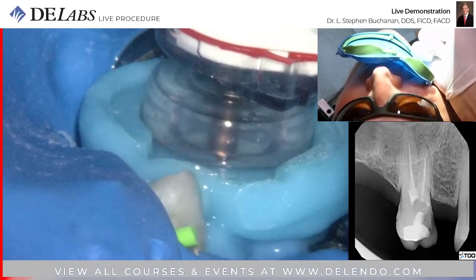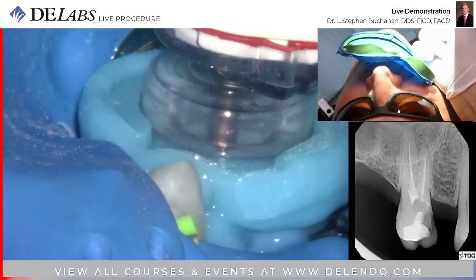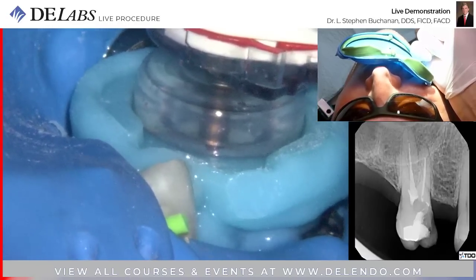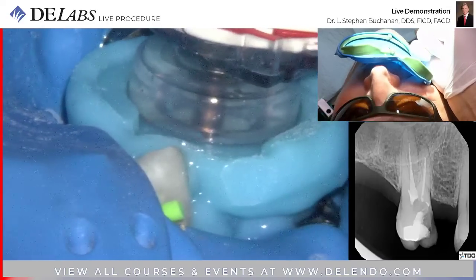Frankly, she does most of this. So I do the leak check. Yeah, what do you need to get? We're out of water? No, for after irrigation, right? After you're done with this. Oh, okay, cool. I'm good.